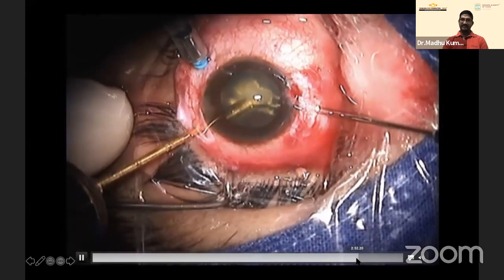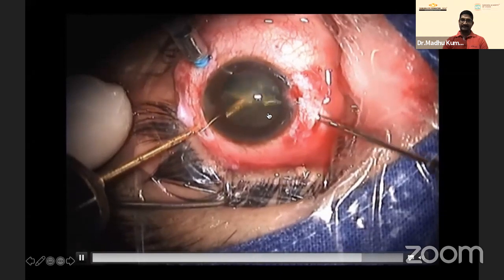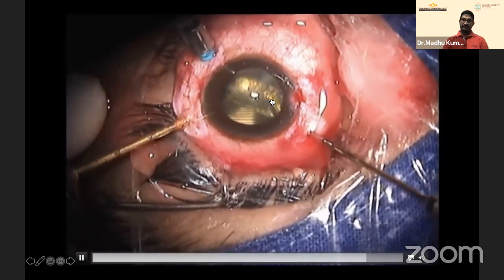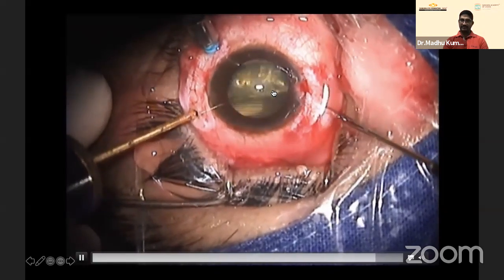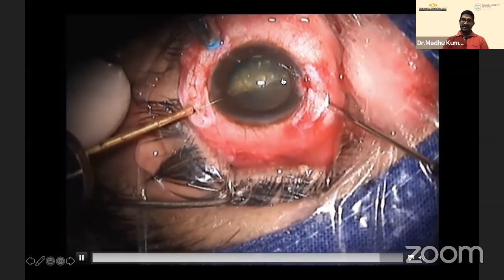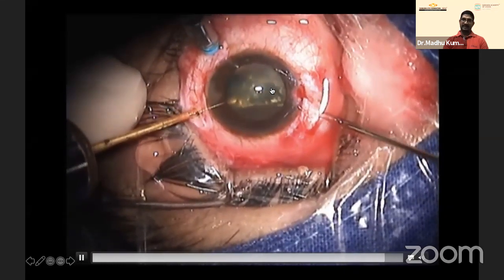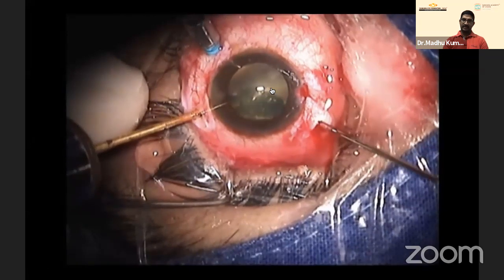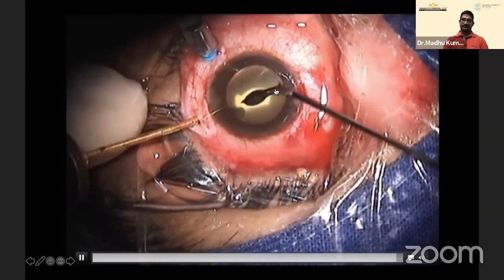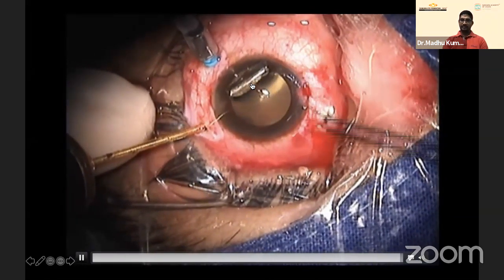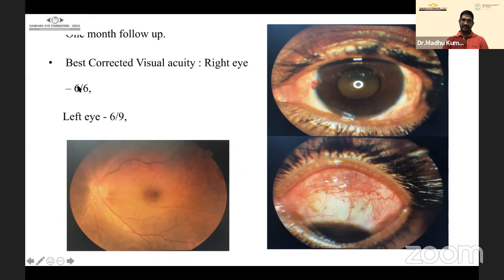The key challenge was engaging the long axis: the shorter dimension must be engaged in the port, but maintaining this axis is difficult because of the irregular edges of the foreign body. The basket forceps was very helpful here. The foreign body was successfully removed. Post-operative best corrected visual acuity was 6/6 in the right eye and 6/9 in the left, with air tamponade used.